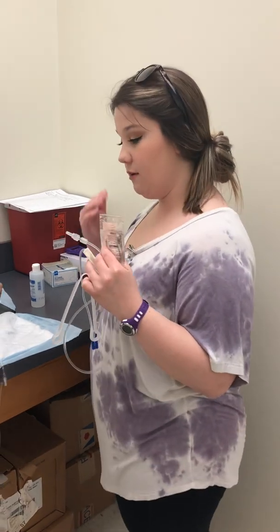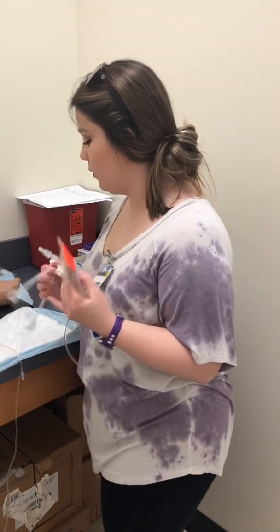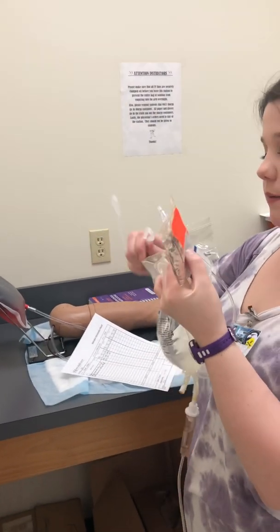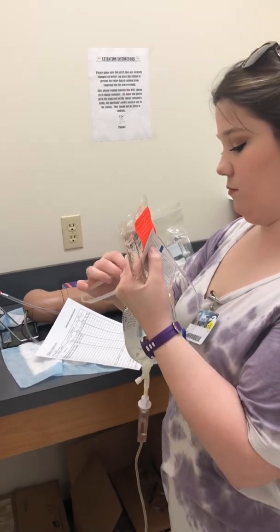Alright, now that I've explained the procedure and I've got my medication right, I'm going to drop this bag. I'm going to lower the primary, if I can. Let's see.